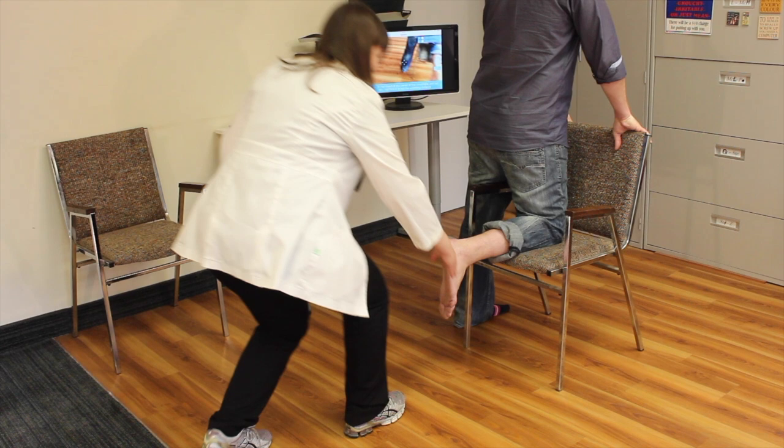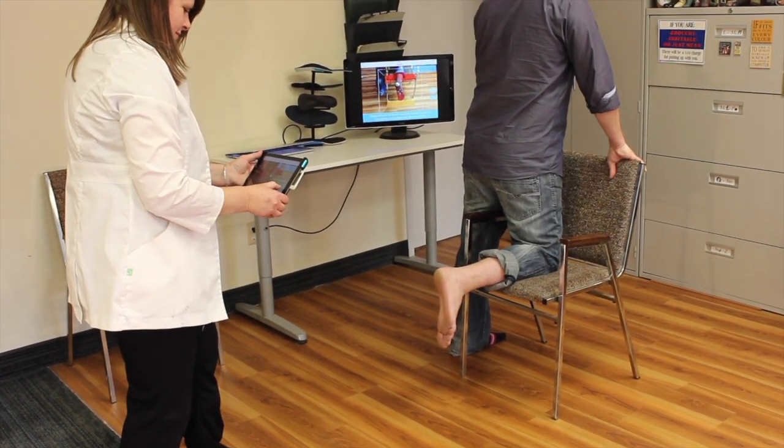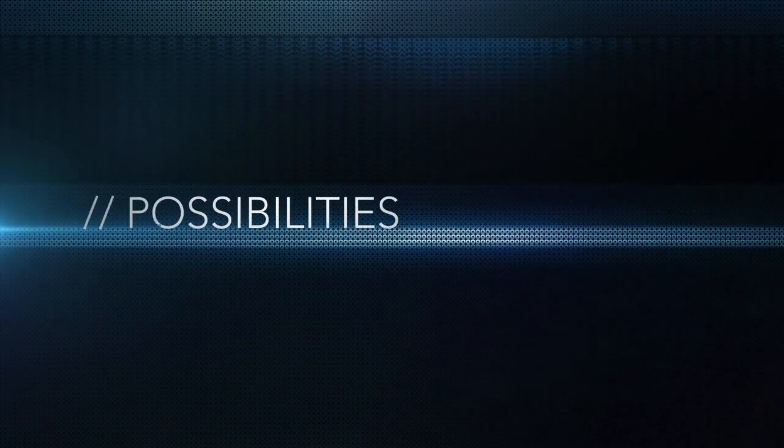Taking a scan is as easy as a few taps of the finger. Complex image stabilization algorithms allow the clinician to move freely around the foot for 360-degree imaging at sub-millimeter accuracy.